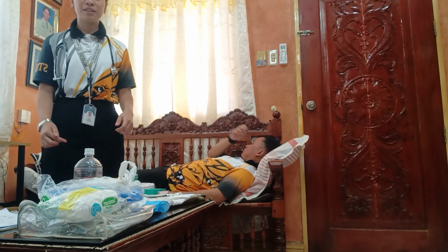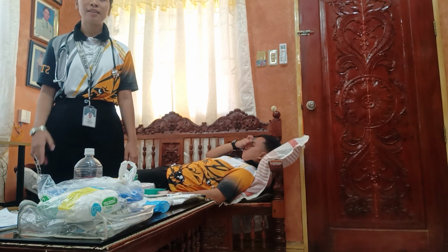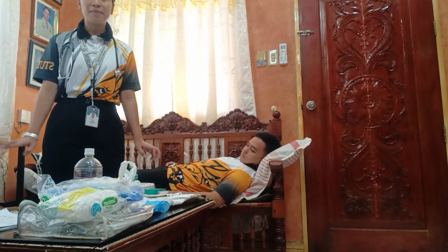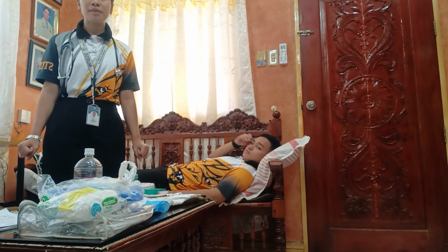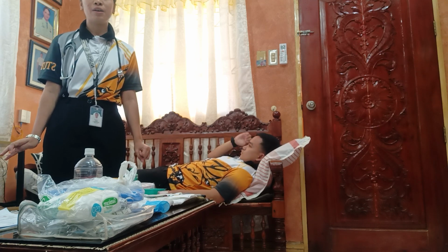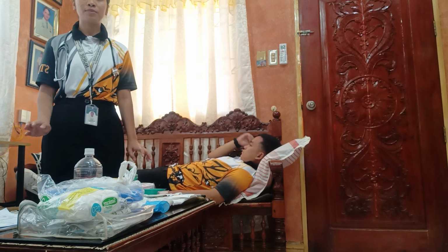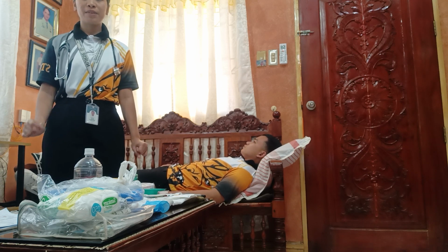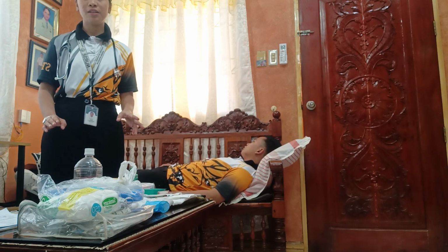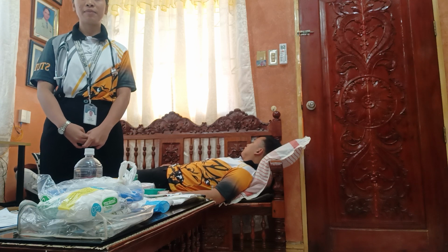And next po, now po I will close the patient's bedside curtains or door. This is to provide the patient's privacy. And also raise the bed to a comfortable working position, usually elbow height of the caregiver, and also assist the patient to high Fowler's position and elevate the head of the bed to 45 degrees.